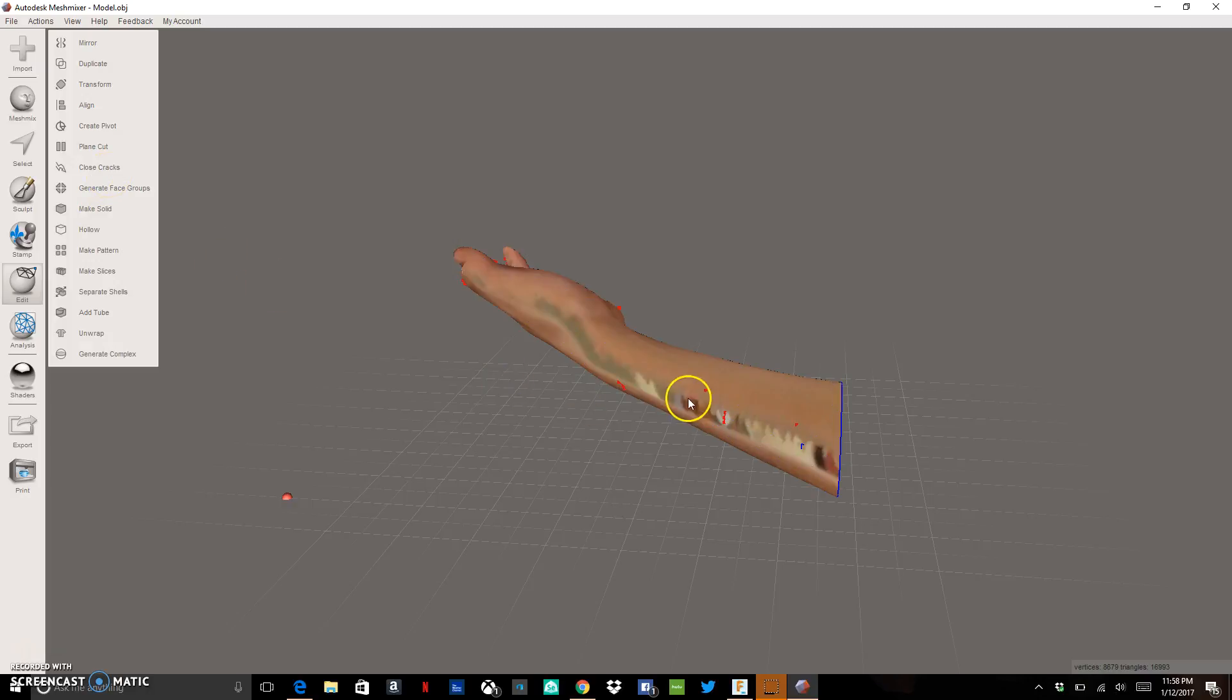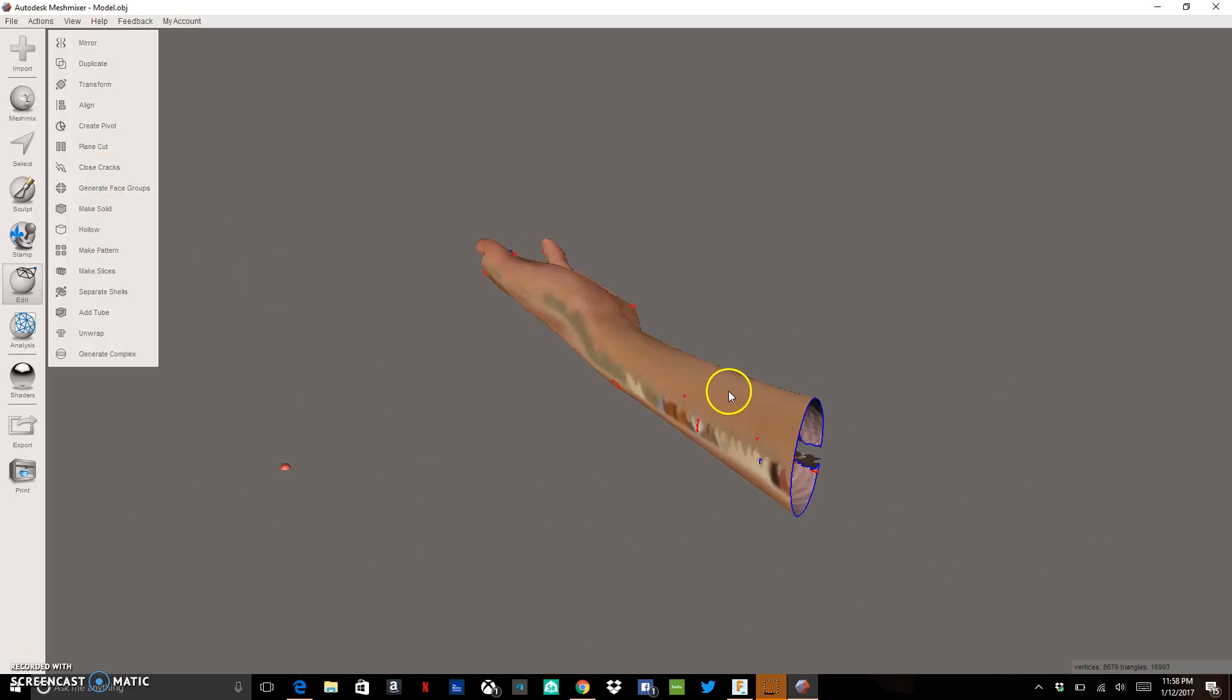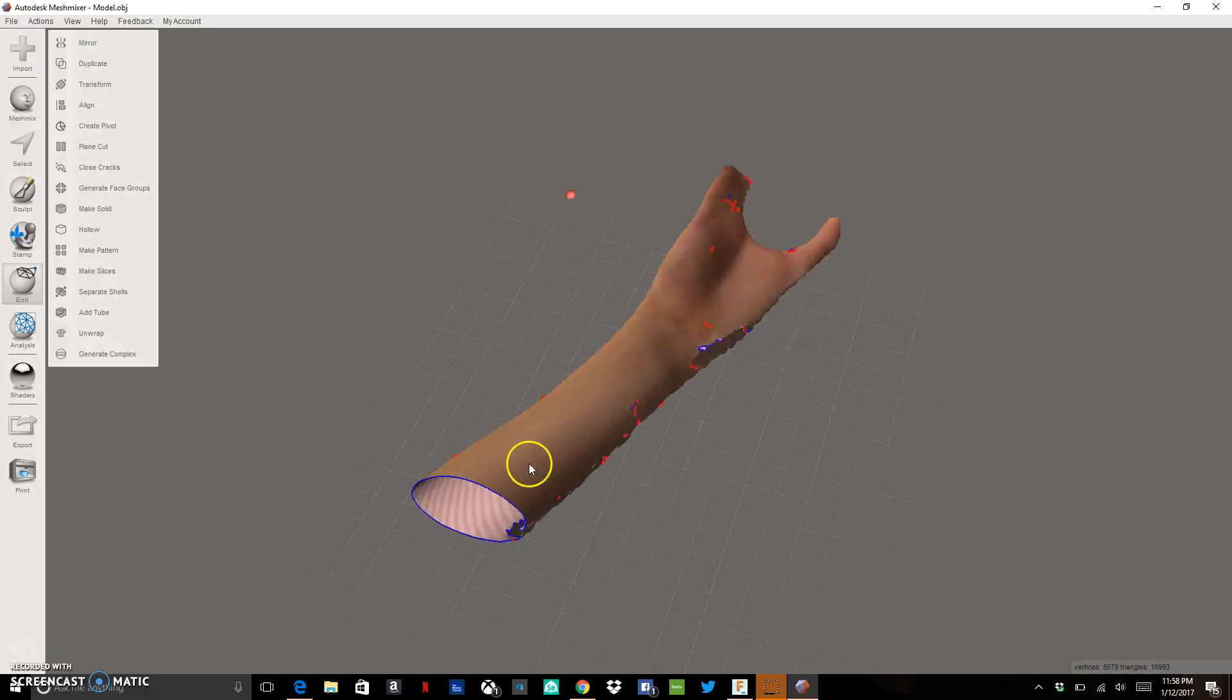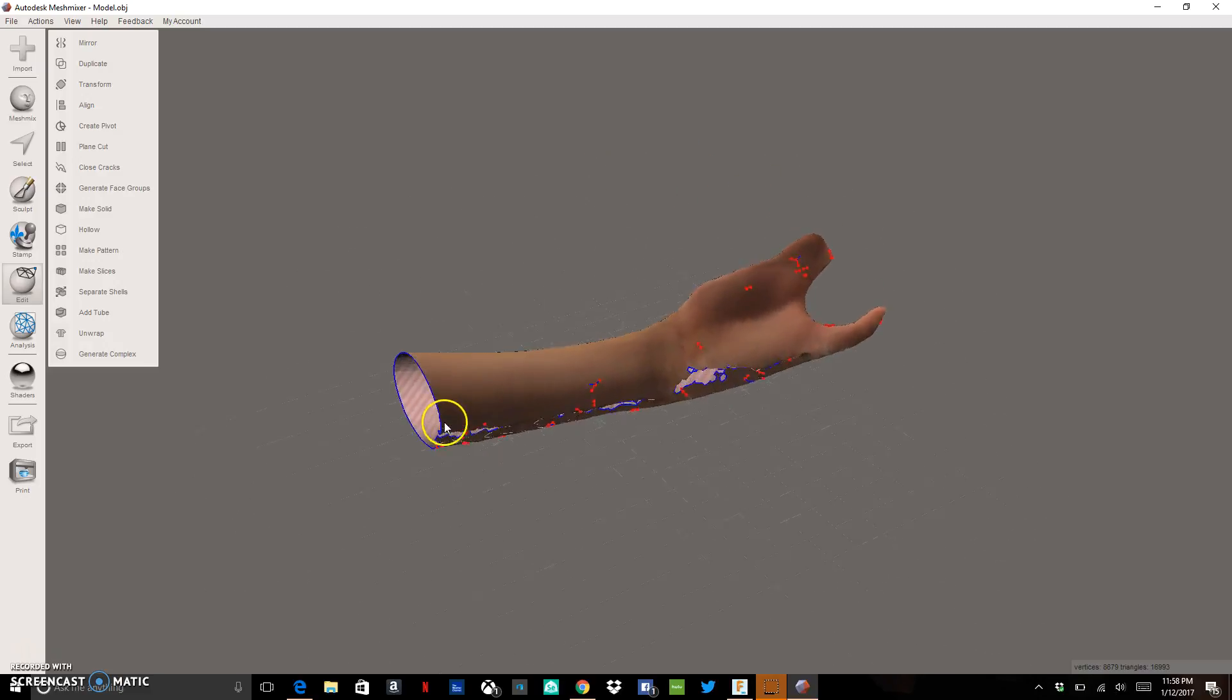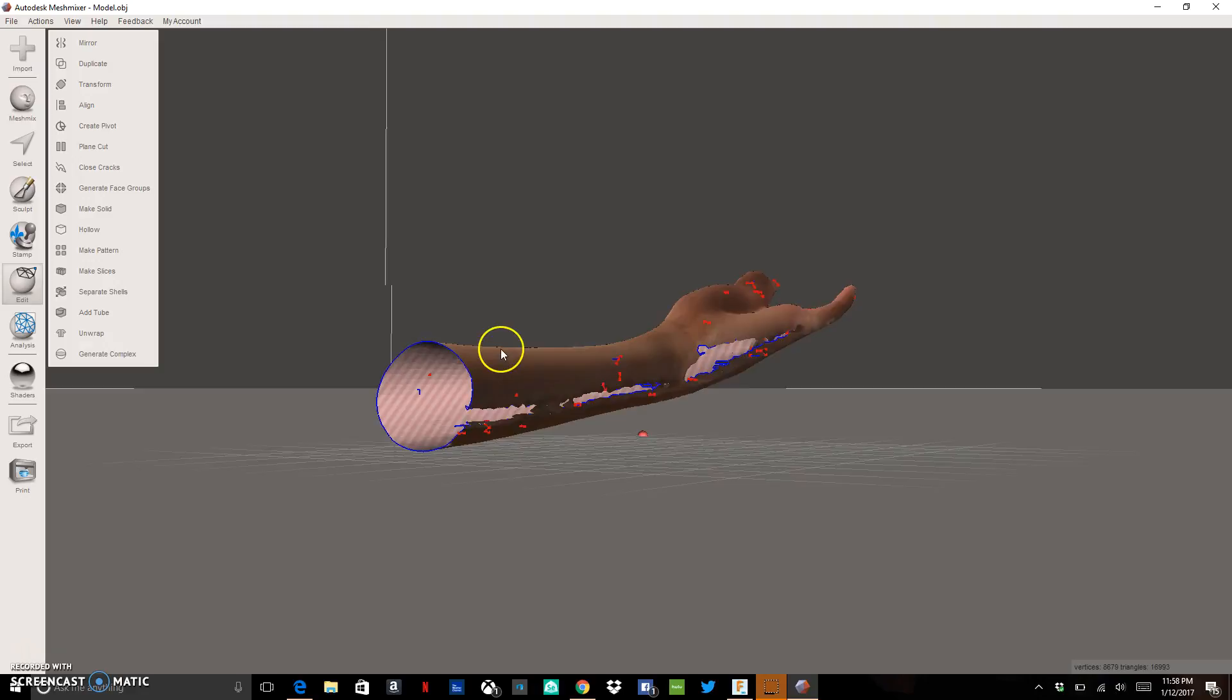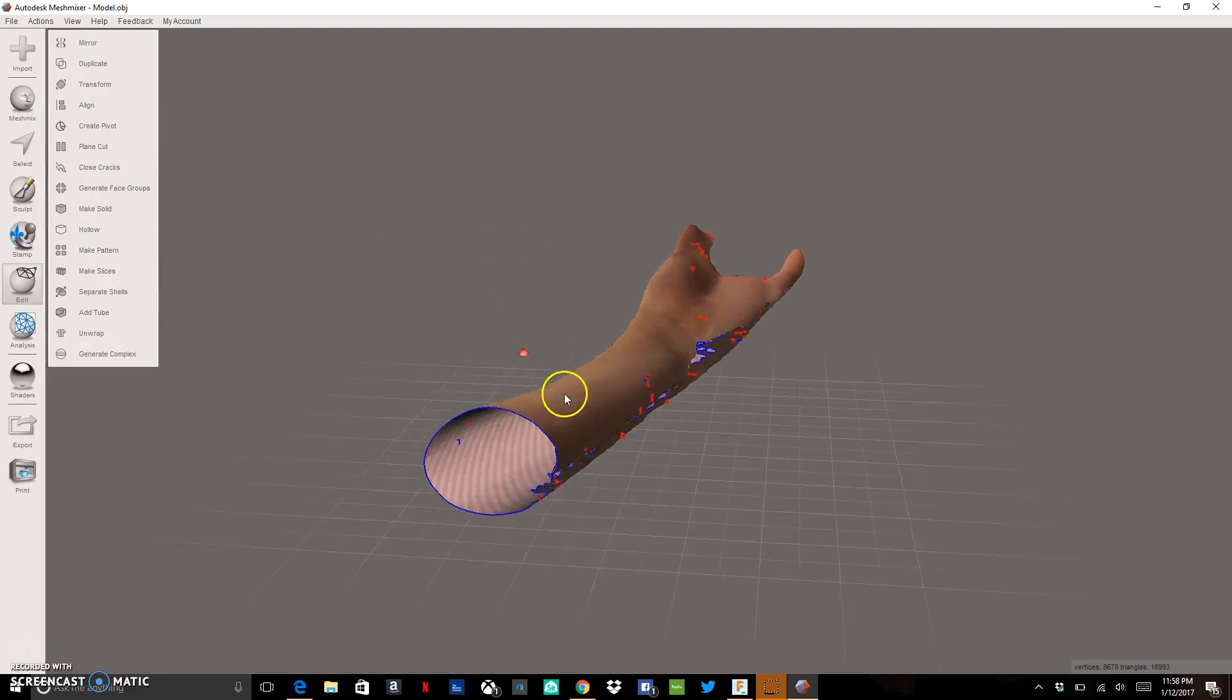We're going to see that a lot of those blue lines are going to disappear. We still have some little red dots. Those little red dots are little holes, little problems with the scan. Same with the blue.